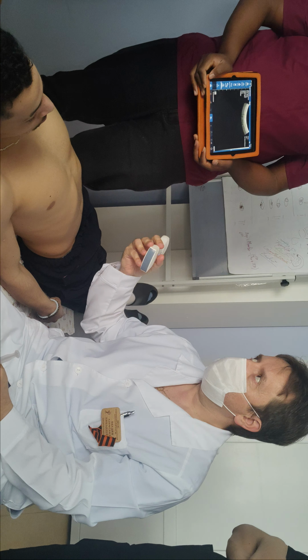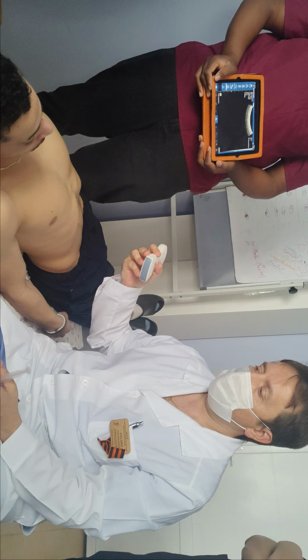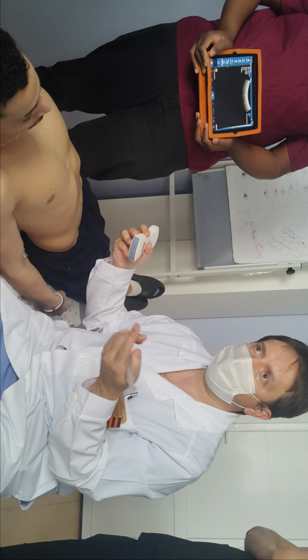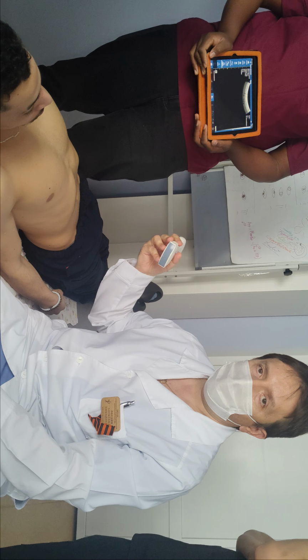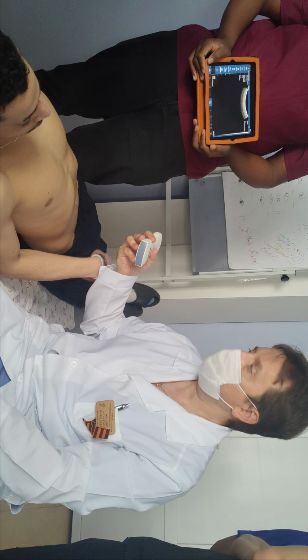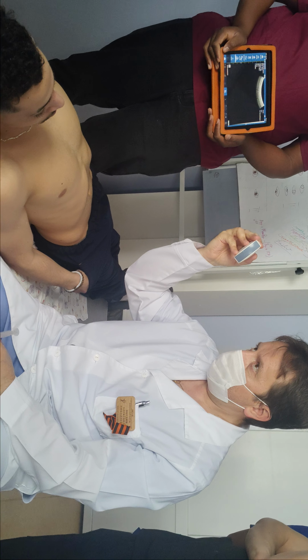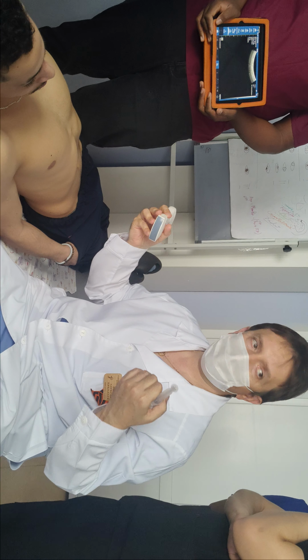Again, your task is to find all necessary positions. Of course, we must not kill him. That's why 2 or 3 persons. Next day, another 2 or 3, maybe with another model. Again, what is unclear, colleagues? What to do is clear. Your task is clear. Perfect. Then I leave this device nearby. Who will be the first? Take my seat and do the same thing.